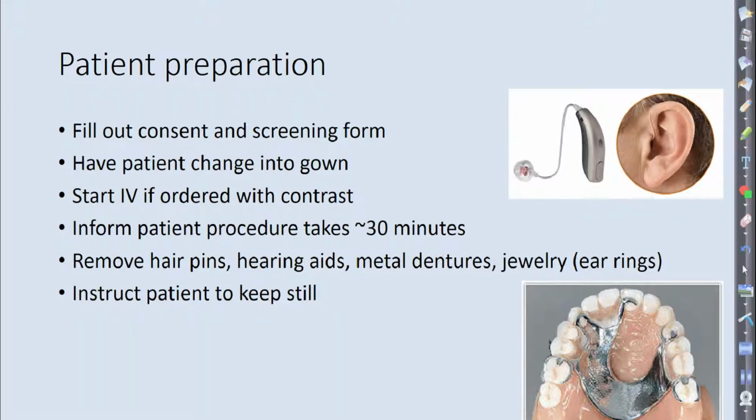Give them that call bell, because we need to monitor the patient visually and verbally. We're going to deal with a head coil, so we need to remove any type of hairpins, jewelry, earrings, and then instruct the patient to remain still. How long do you think this is going to take? 30 minutes. Give them a time frame, but don't ever undershoot it. Don't say 10 minutes and then they're in there for 30, and they're going to be mad at you, asking why that took so long. So for brain without contrast, you could say 30 minutes. With contrast, 35, 40 minutes sometimes, because you have to add a couple extra sequences.